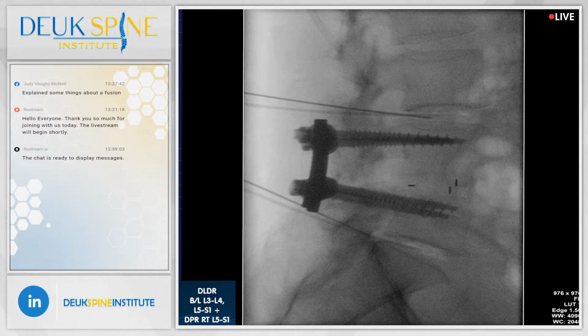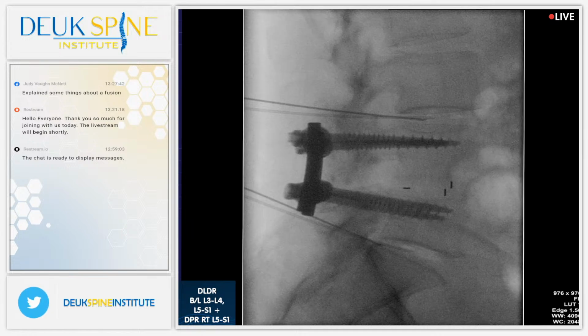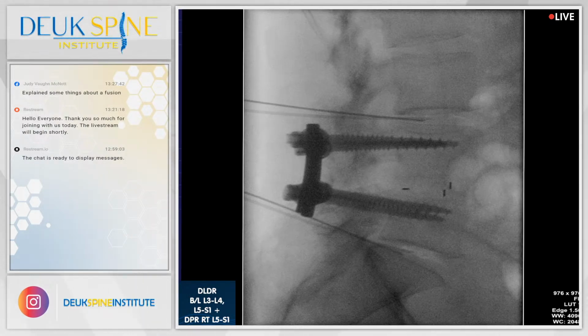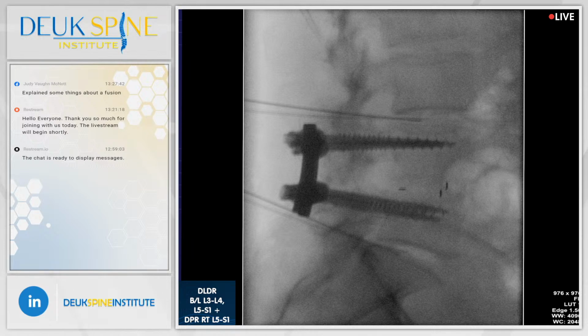How is he doing? You okay? How you doing, my friend? Where do you feel that? Where are you feeling that? Shot. Right hand. Your hip? Oh man. I can't believe we got it. Yeah. Shot. Where do you feel it? In your back? Interesting. AP? All right.